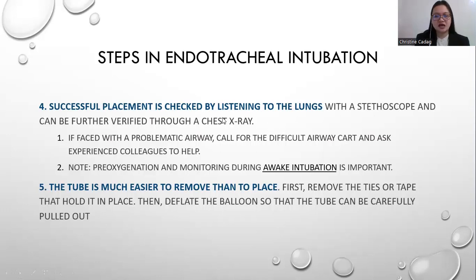So next, if faced with a problematic airway, call for the difficult airway cart and ask an experienced colleague to help. Note that pre-oxygenation and monitoring during awake intubation is important. So what is the meaning of awake intubation? It's used in patients with a predicted difficult airway or unstable cervical spine. During intubation, the patient is awake, and if the intubation fails, they will stop and the patient can help himself to breathe.